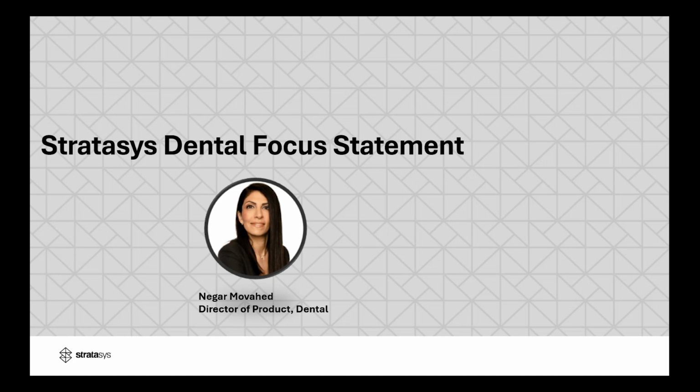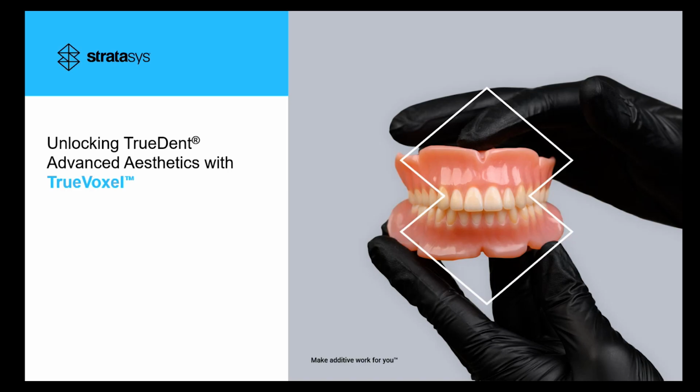When you look at the RPDs, this is one of those examples where we trusted our internal expertise, people who have actually managed labs, to say this is where we really need to go. So we are open to suggestions and feedback. We are listening. We have a roadmap filled with innovation, meaningful improvements, and also partnerships that you're going to hear about. And we're happy and grateful for you to be on this journey with us.